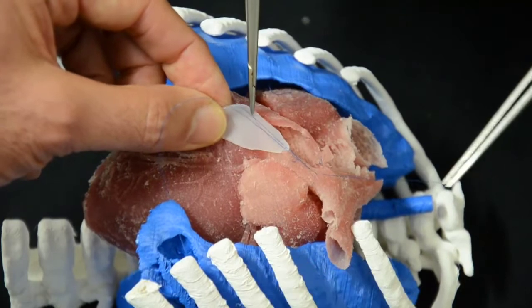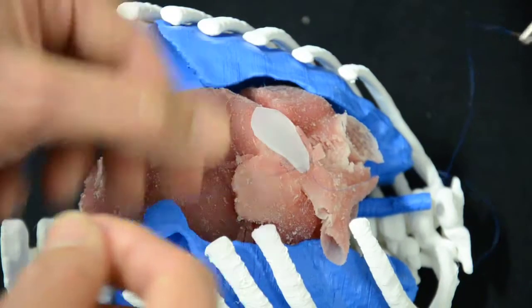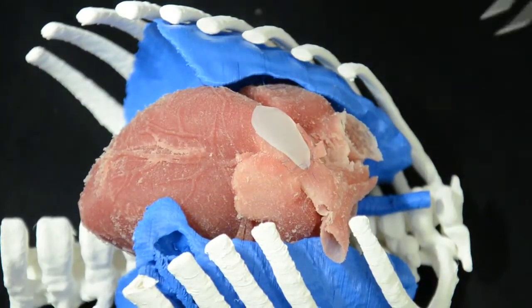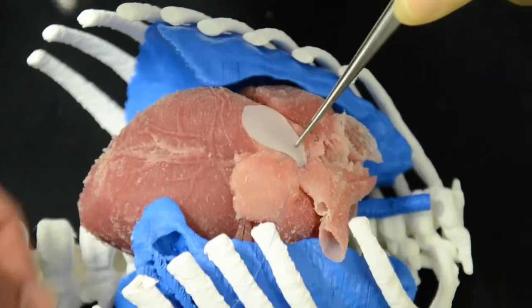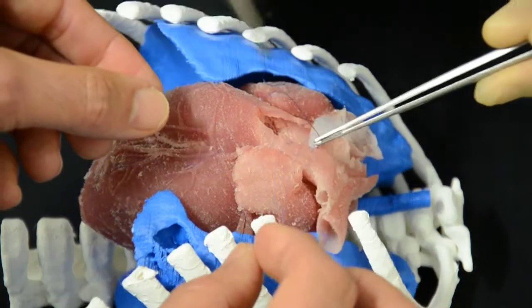As you can see, the sutures have to be spaced absolutely perfectly, within millimeters of each other, because what we need to avoid is any bleeding, which will be at very high pressure inside.